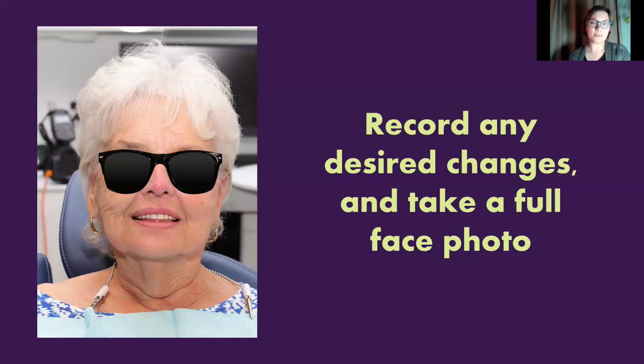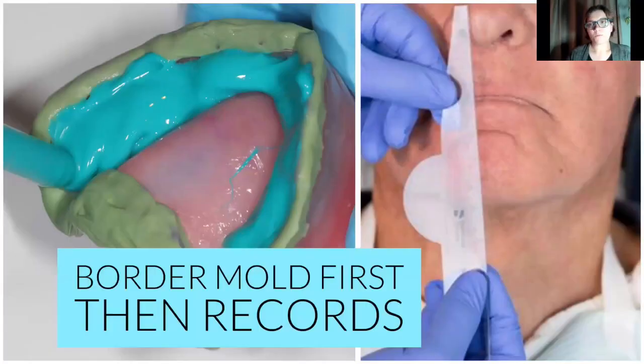The most important thing here is that the patient is looking at the camera straight ahead. If they turn their head to the side one way or the other, then it's going to be hard to align that patient's existing denture into their smile design. You also want to, if possible, see the patient's ears. That helps align the digital articulator. So border mold first, then do your records. Take your impression first, then do your records.